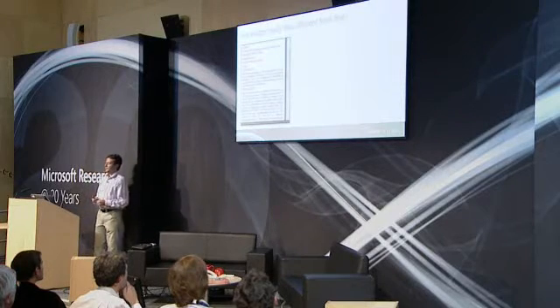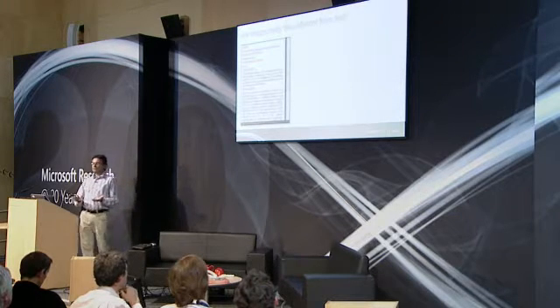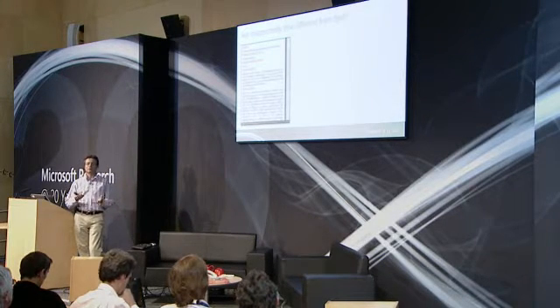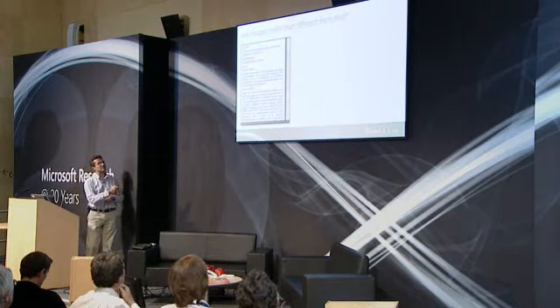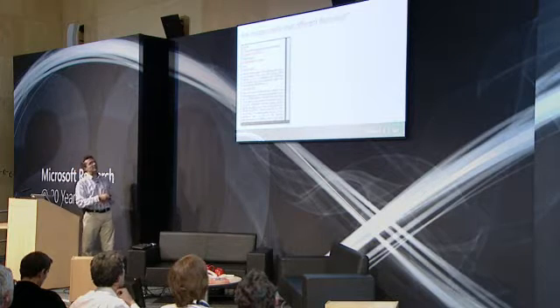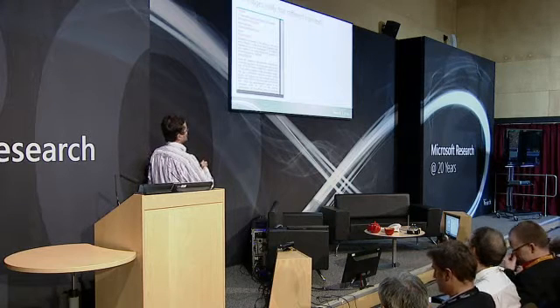There is another interesting aspect to all this. What is an image? An image is nothing but a document. So normally we're used to thinking about documents in terms of written text, such as this. This is a radiological report which says, in different paragraphs, what's wrong with the patient and where. An image is also a document. It's just much more difficult to read and to interpret. But all the information is in there. All the information that is made explicit here in terms of text is also present most of the time in the image itself.